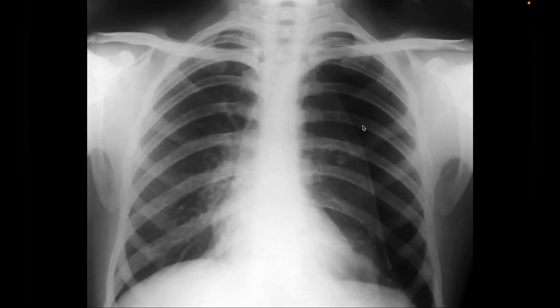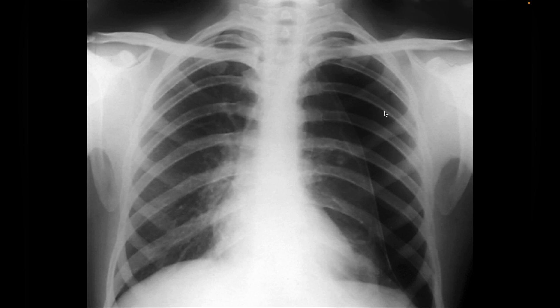As I mentioned before, you can see the parietal pleura right here in this case, and the costal part of the chest wall here. There is a space between them filled by air — in a normal thorax this would not be present, and in this case immediate surgical procedures will be needed.